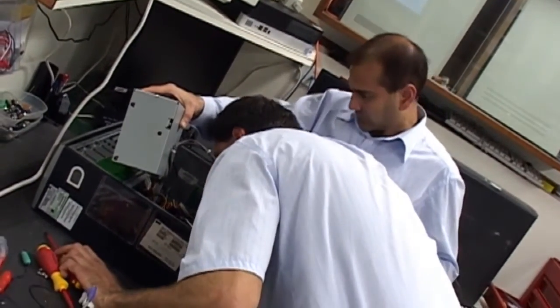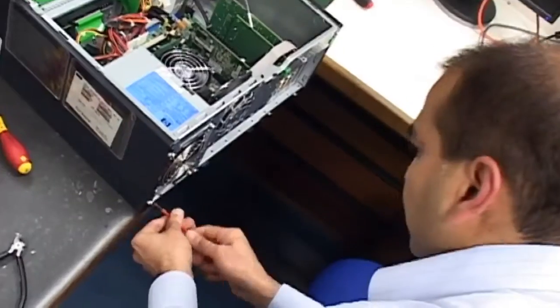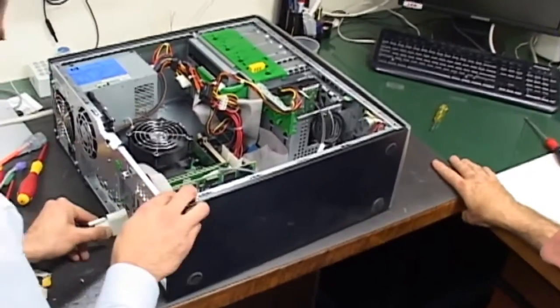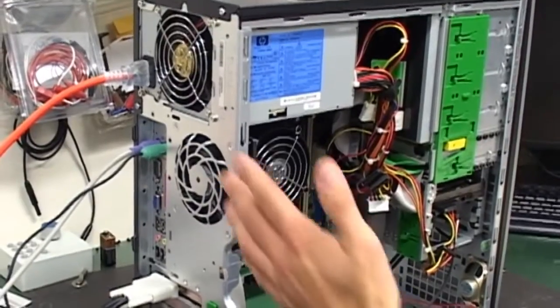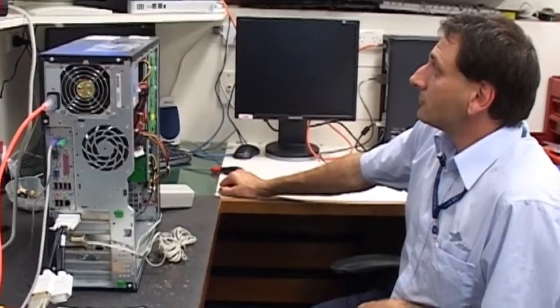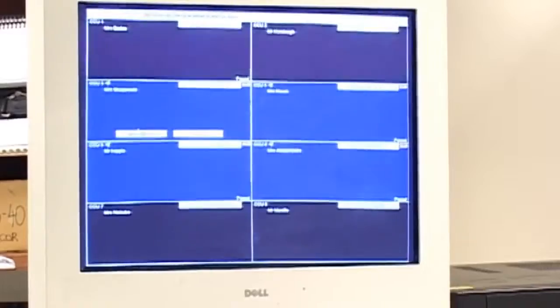As far as central stations goes and patient monitoring, that's where the IT component is. So if something happens to it, if it crashes or glitches for whatever reason, you need to understand the computer basics behind it, how to resolve that. Does it need your standard restart? Has a hardware failed on the computer? Was it just a glitch where a reboot is more than enough?